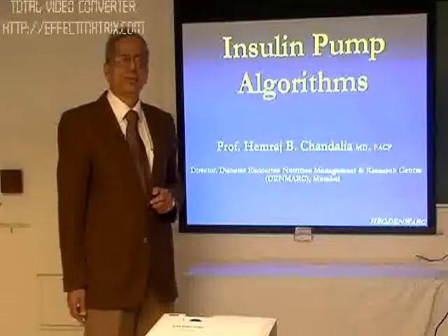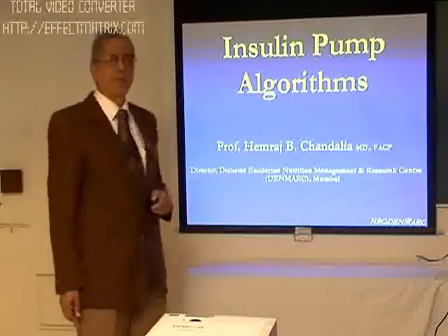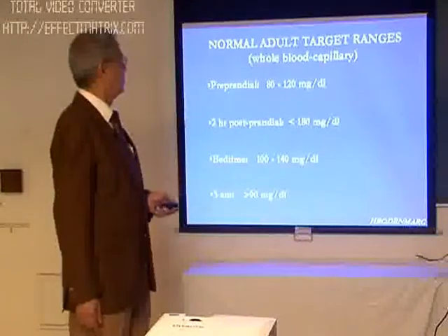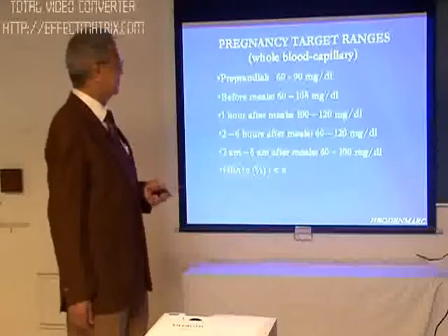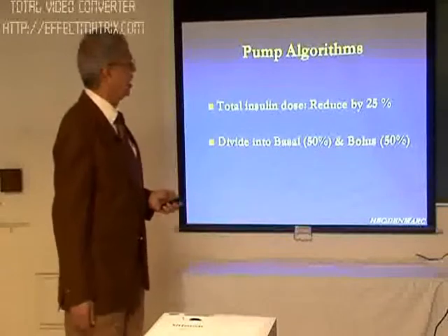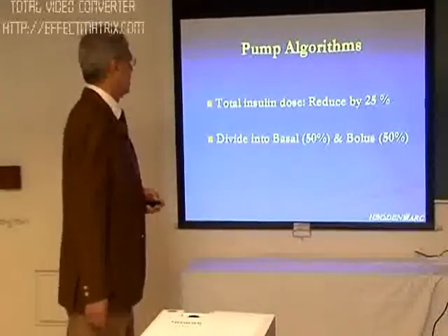Now we will be discussing the insulin pump algorithms. We had already looked at the target values which you desire to achieve on pump therapy. Now how do you achieve that, and how do you plan your basal and bolus doses on the pump therapy?